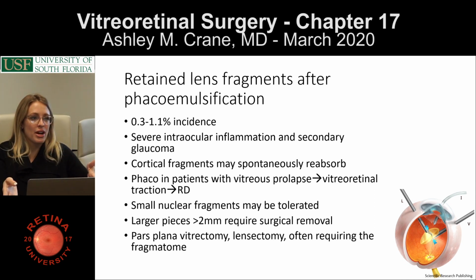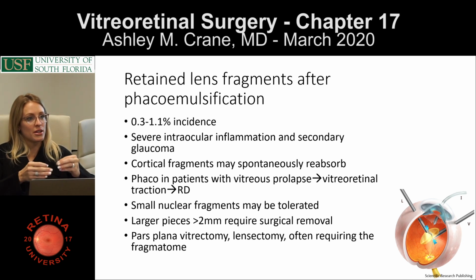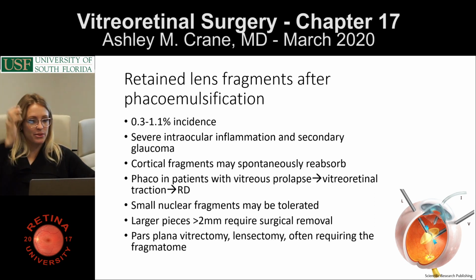I used to use glycerin. It's not usually available in a lot of places, but that can help you quickly. You can scrape the corneal epithelium if there's epithelial edema. That doesn't necessarily always help the stromal edema, but if you can get one of those out of the way, oftentimes the only thing we have to do is get the nuclear piece out. We don't necessarily have to make it the prettiest surgery with a nice peripheral shave. It's kind of get the nuclear piece out.